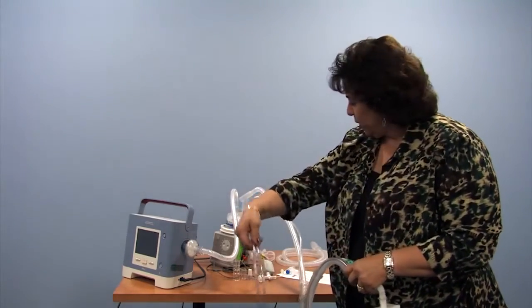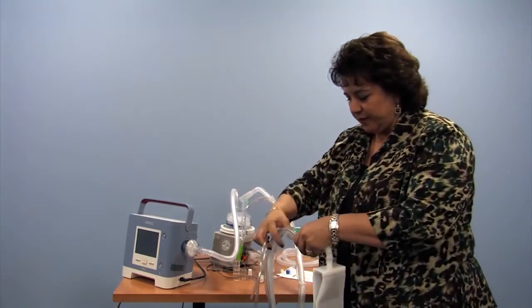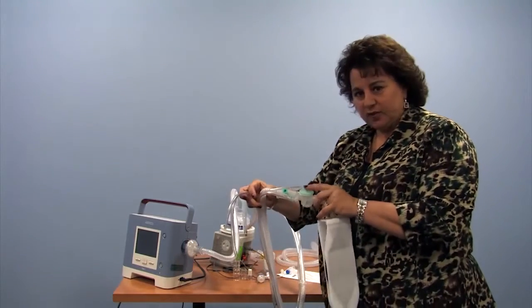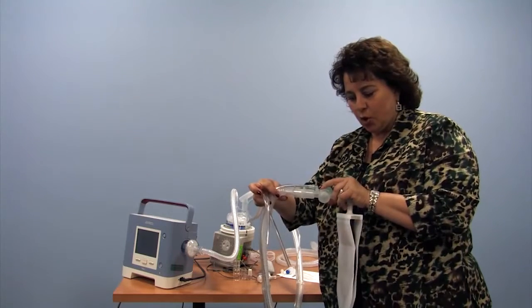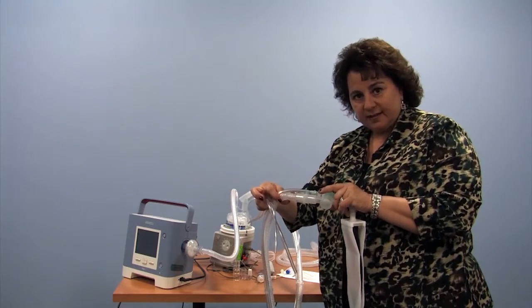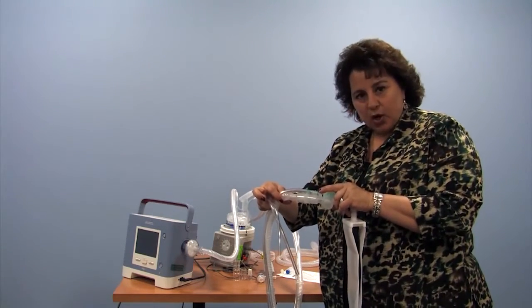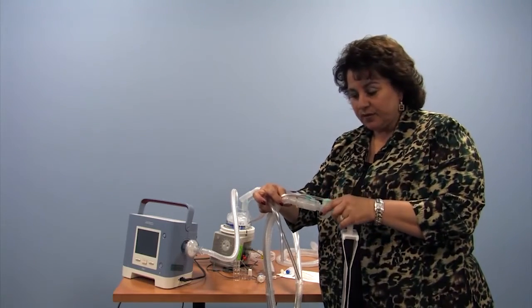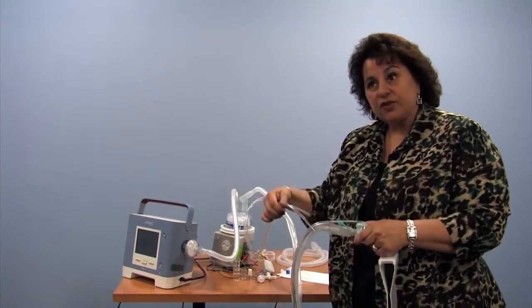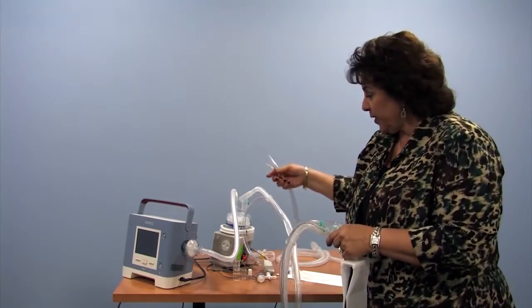Now you see there are two other hoses here. And if we follow the hoses, we'll see that one of them goes to the exhalation valve and one of them taps into the side of the hose. This is where the machine sends information about what's going on with the child, as in pressure, for example, within the circuit. It also gives information to the machine to be able to work with alarms.